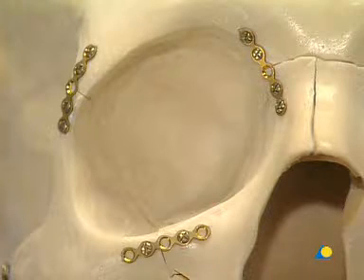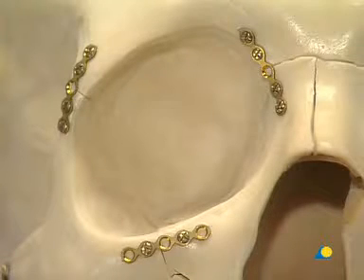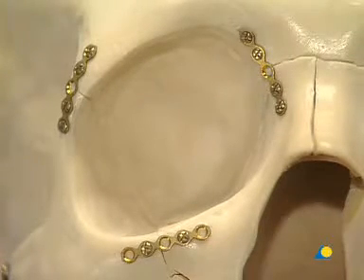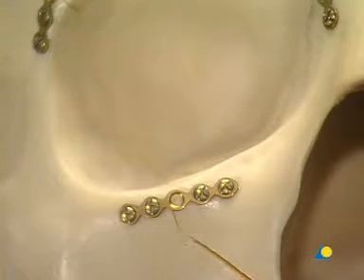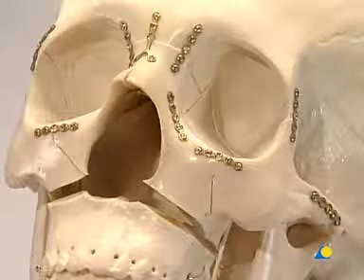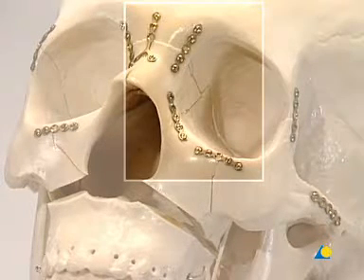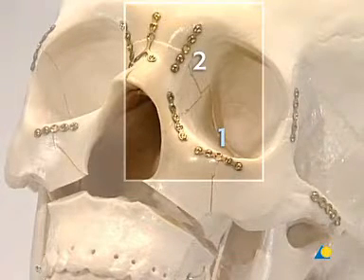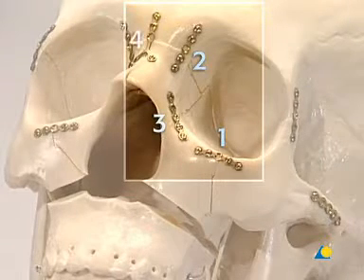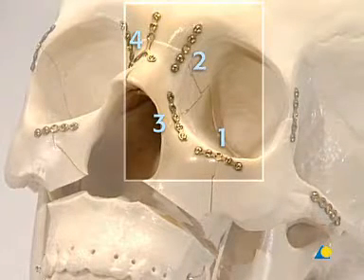Plating of the right orbital aperture will be completed with reduction of the medial maxillary nasal segment. The nasal frontal and the inferior orbital rim fracture plating is done with 1.3 plates, with a minimum of two screws inserted on each side of the fractures. The reconstruction of the left orbital rim starts with anatomical realignment of the fractures. 1.3 plates are placed at the inferior orbital rim, the nasal frontal fracture, and the nasal maxillary process. An inverted 1.3 Y plate is used for further reduction and stability of the nasal skeleton.